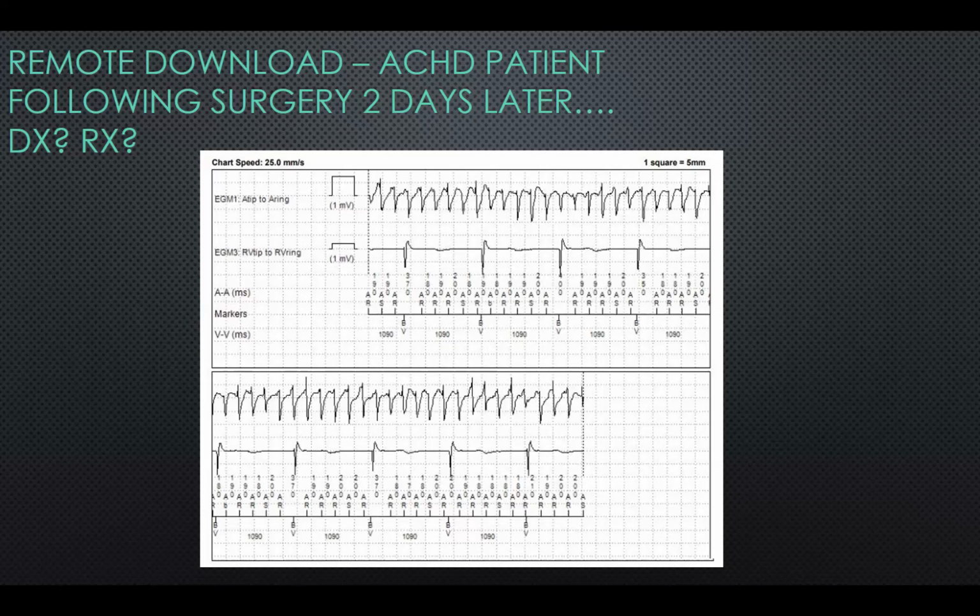But yeah, this demonstrates, I think, nicely the benefits of remote monitoring. This was actually just picked up by Jack when he was doing remote monitoring of our patients, which he does every morning. Aside from putting them in a nice electronic folder that's protected for me to review, he's also reviewing them, and he astutely noticed this in this patient and informed me, and that's how we got going in managing the patient.